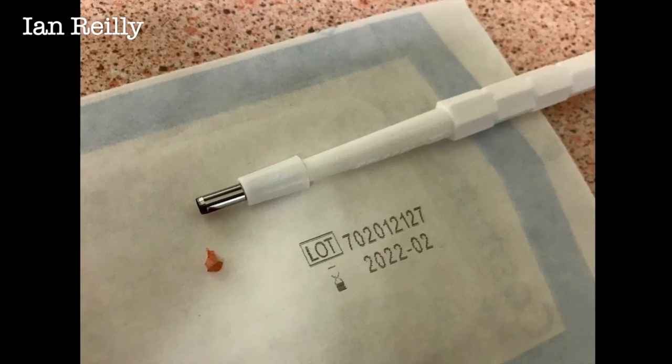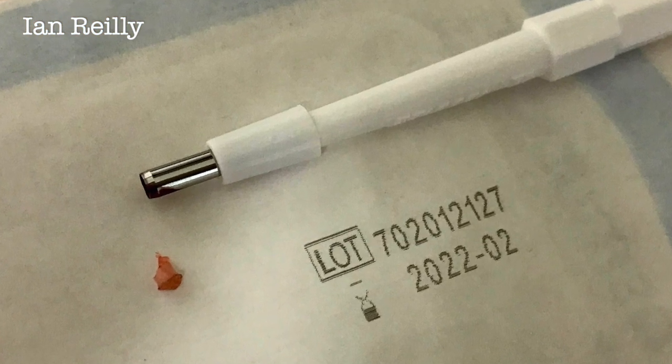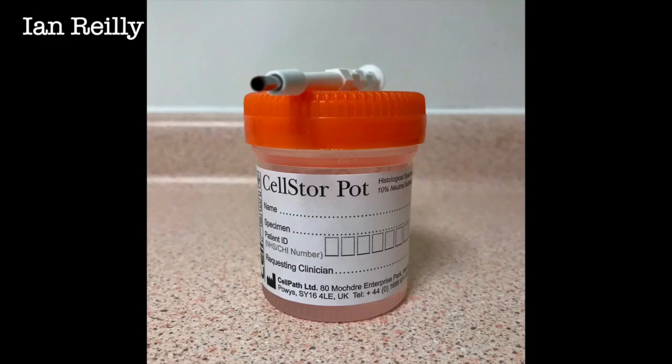Here's the sample, really quite small. It comes out of the punch, goes off into a pot, then to histopathology. Here's the pot. And of course, we absolutely make sure that we check for the results in about a week or 10 days' time.